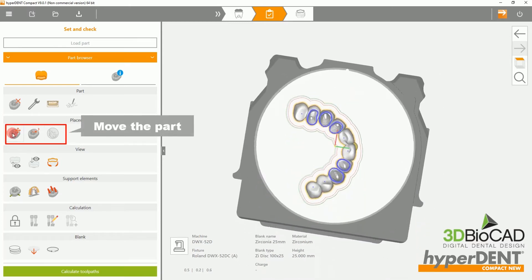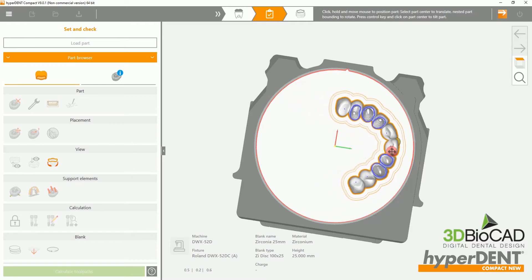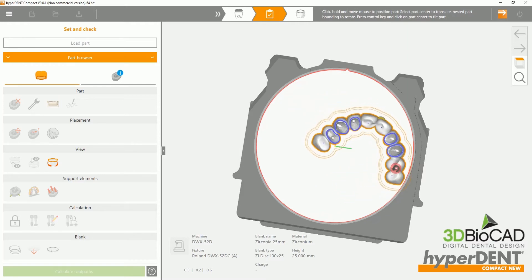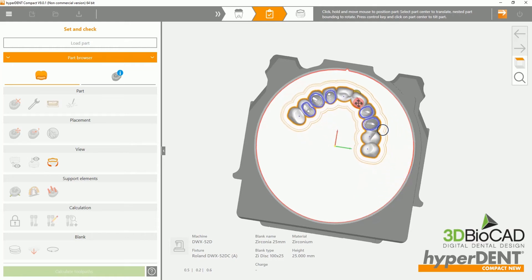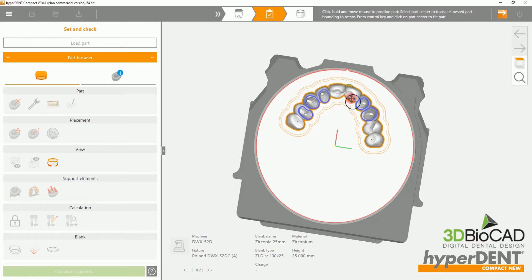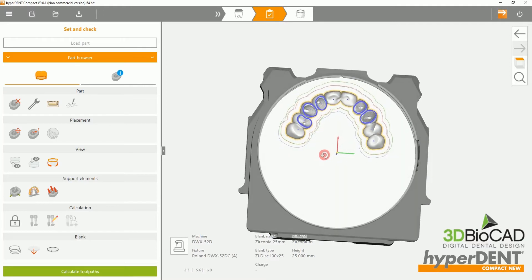Please select the Move Part option and move it towards the edge or wherever you prefer. Here, you can twist and move to wherever you feel is right for your blank. Please ensure that it does not touch the red line outlining the blank.